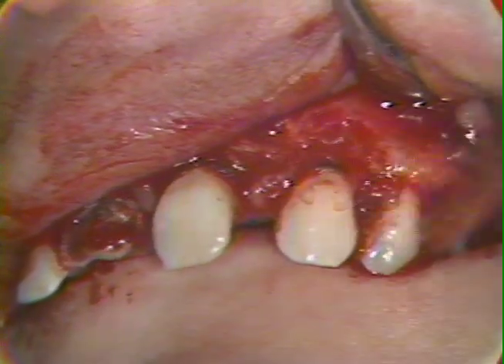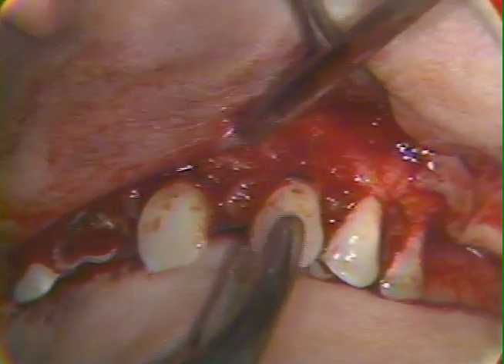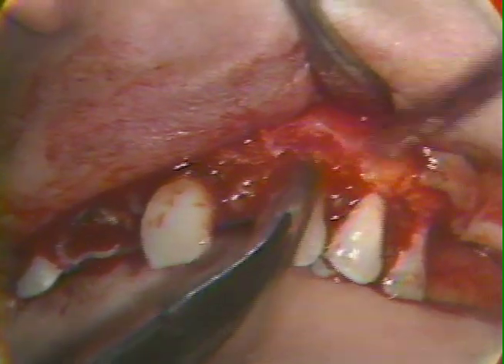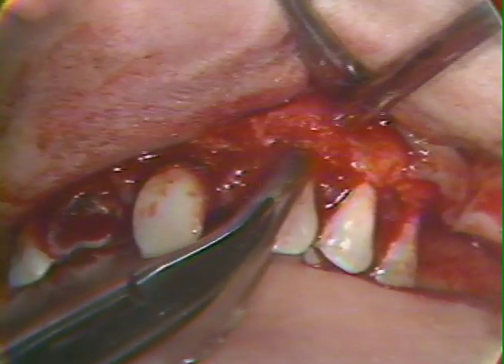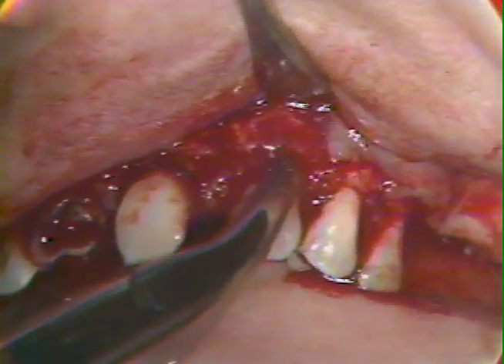As we indicated earlier, because the cuspid root is so long, we tend to remove it first, placing the beaks of the forceps well up on the root, and then proceeding with the mobilization of the canine.